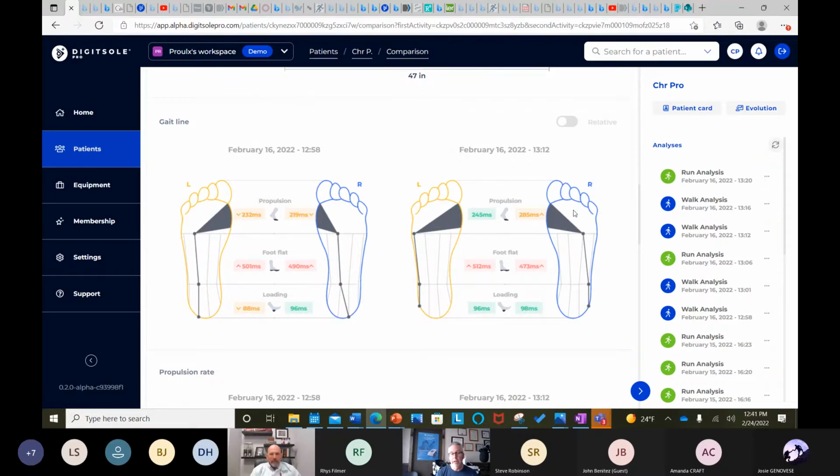So over here on the left picture, that's the shoe that pushes you into more supination. And what it means is it has a much higher arch. So even initially, the sensor is actually going to be somewhat deviated. And so you want to know that to take that into somewhat of a consideration. So if you're looking at complete level horizon, and that's important to you to establish that, make sure that your patient is in a relatively neutral shoe.